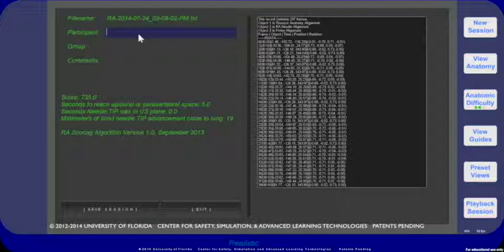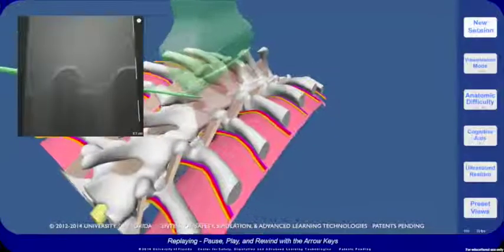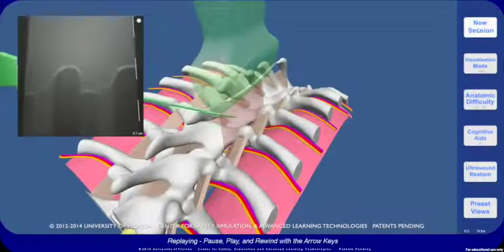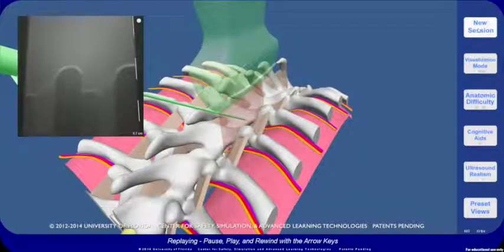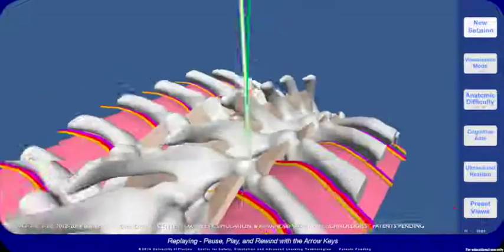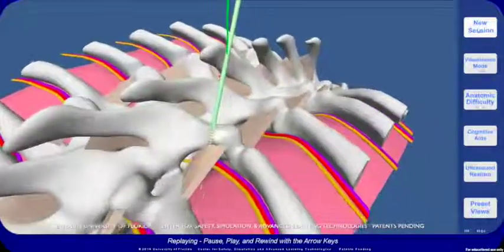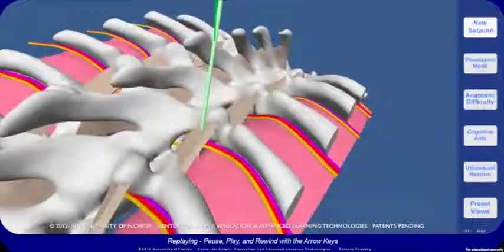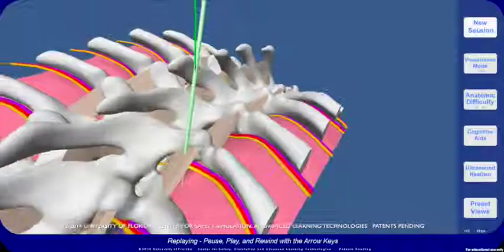Any past procedure that has been saved may be replayed. All view options are available during replay, and the virtual camera position can be changed during replay to optimize debriefing.